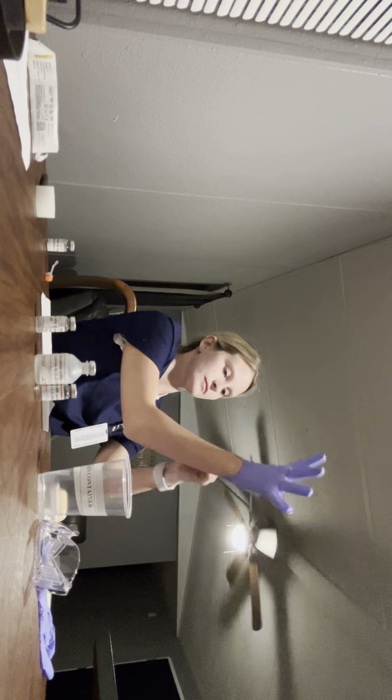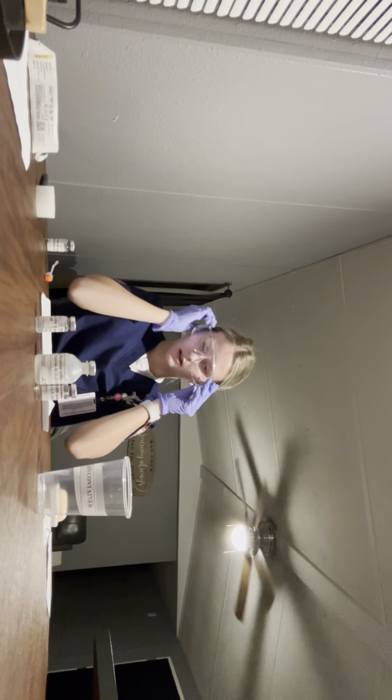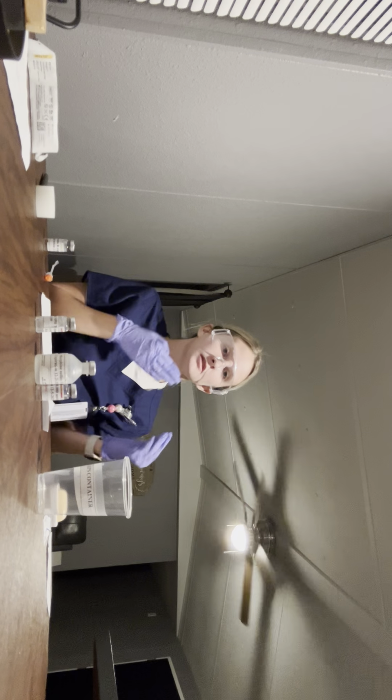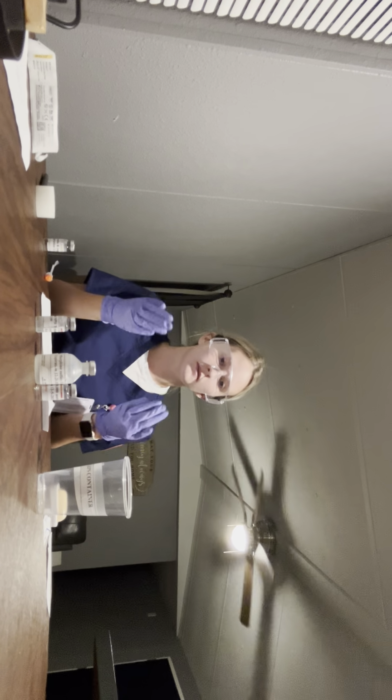So now I'm going to put my clean gloves on. Okay. Struggling just a little bit. And then my goggles. Okay, goggles. And then I'm going to tell you where I will give the injection for insulin, which is in the abdominal injection site, which is below the costal margin, above the pubic region, between the anterior superior iliac spine, and 2 inches away from the umbilical region, which is your belly button.